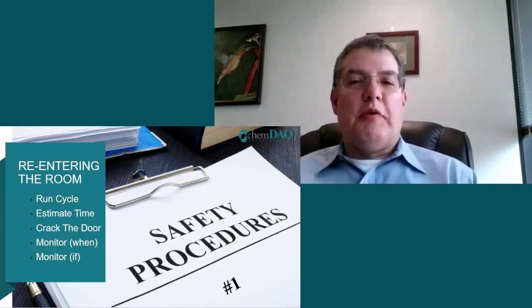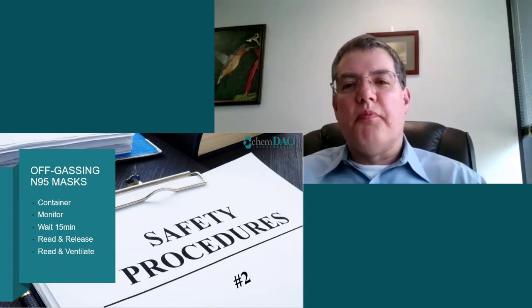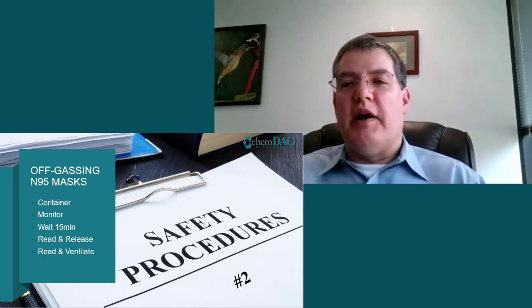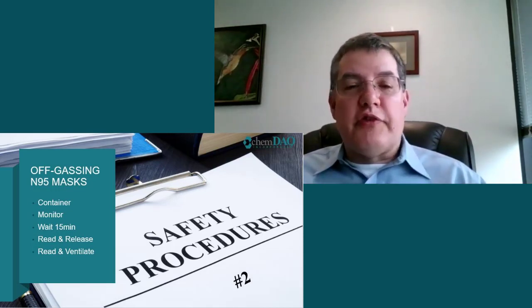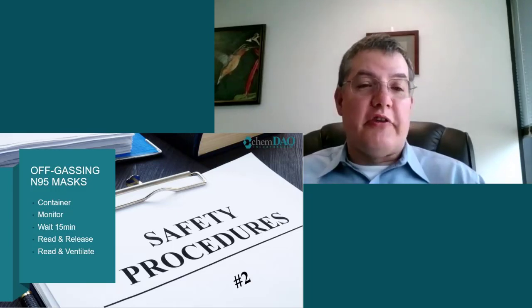Bob, you brought up off-gassing a moment ago, and this is the other big issue. It is important that we ensure that any residual hydrogen peroxide off-gassing is sufficiently low enough that the next person who wears that mask does not breathe in hydrogen peroxide vapor. We've already discussed that hydrogen peroxide vapor is highly toxic. Otherwise, it would be no good as a sterilant.